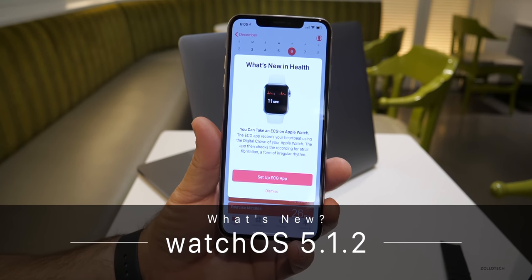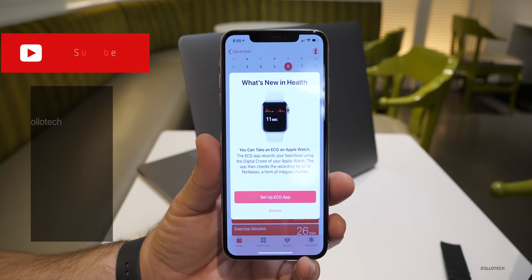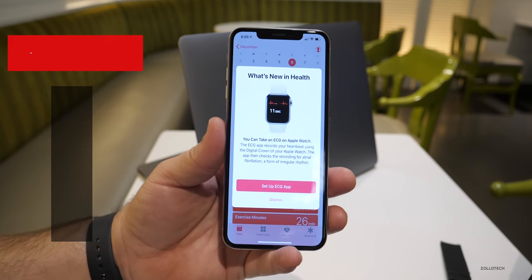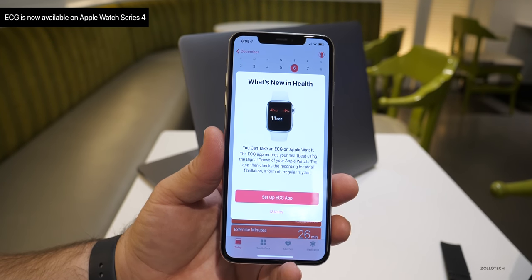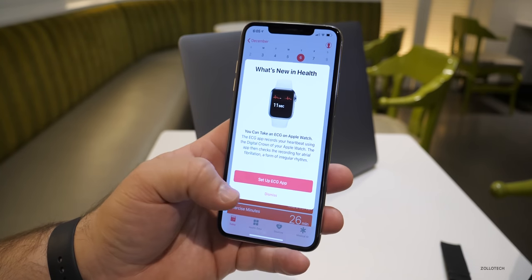Hi everyone, Aaron here for Zollotech. I'm away right now — as you can see, the scenery is a little bit different — but today Apple released WatchOS 5.1.2 with a major update featuring the ECG, or electrocardiogram. This is a huge update for the Apple Watch Series 4, and let's go ahead and get the app set up.